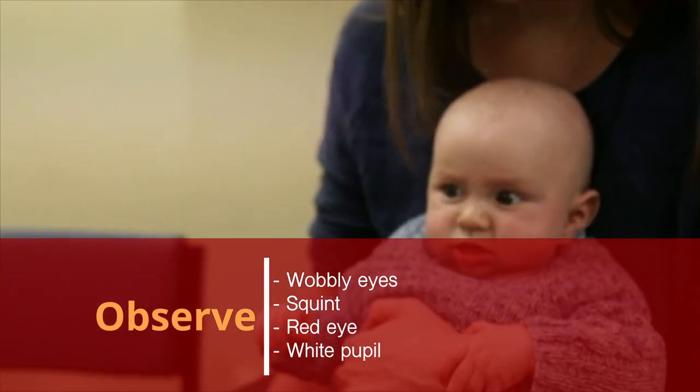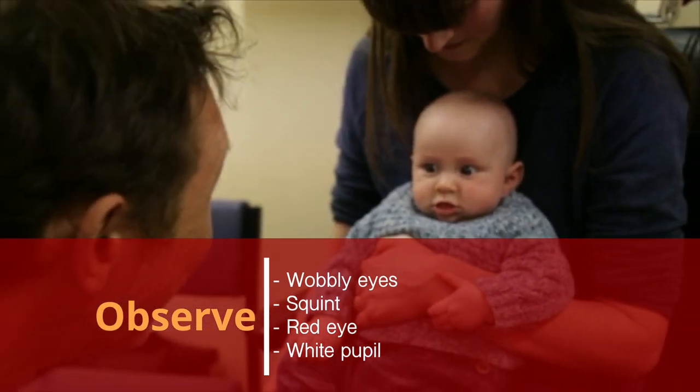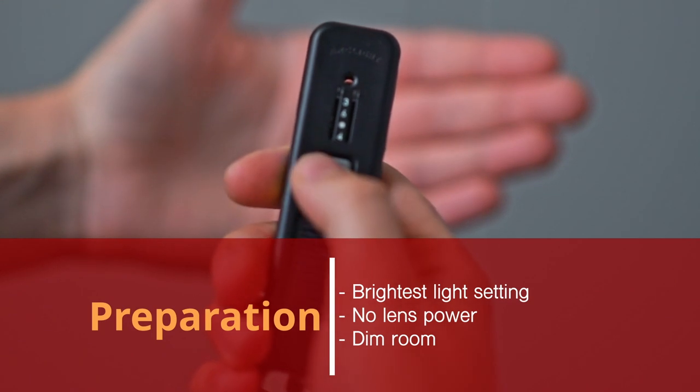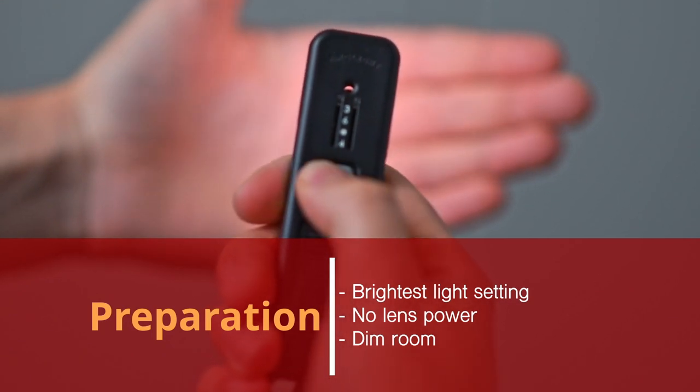At the same time, look for any signs of wobbly eyes, squint, red eye or white pupil. Then prepare the Arclight by selecting the brightest light setting with three clicks.